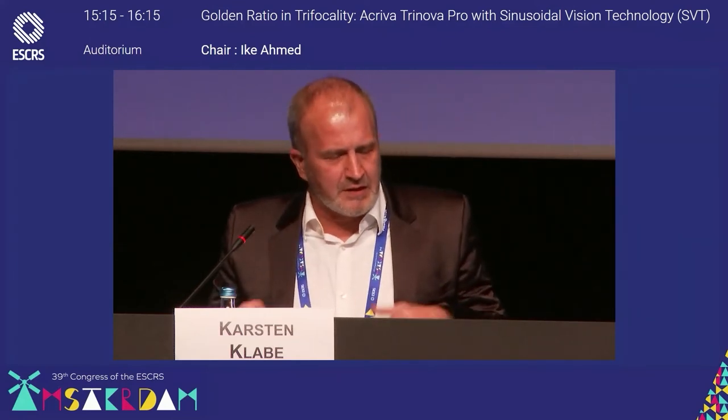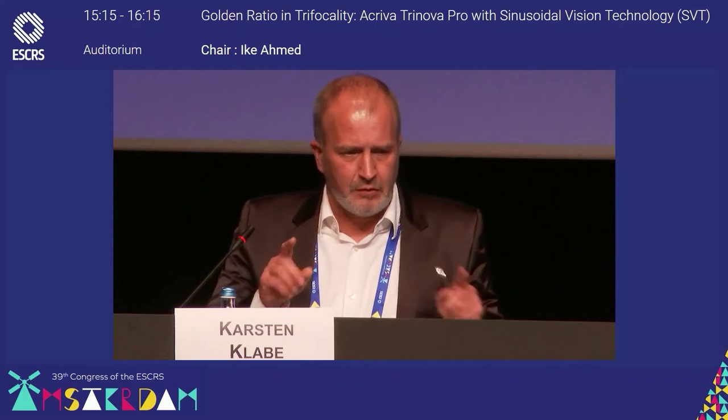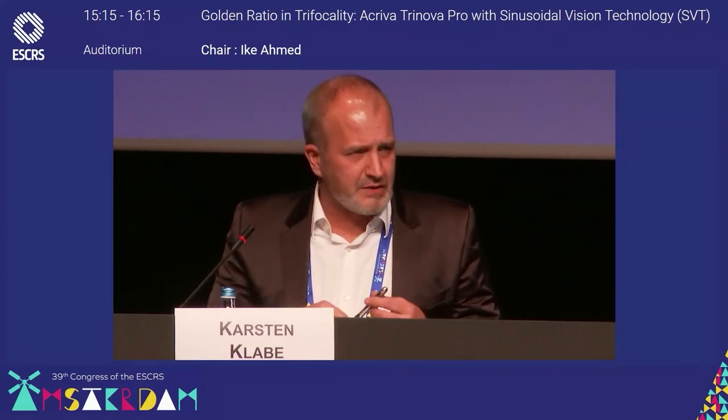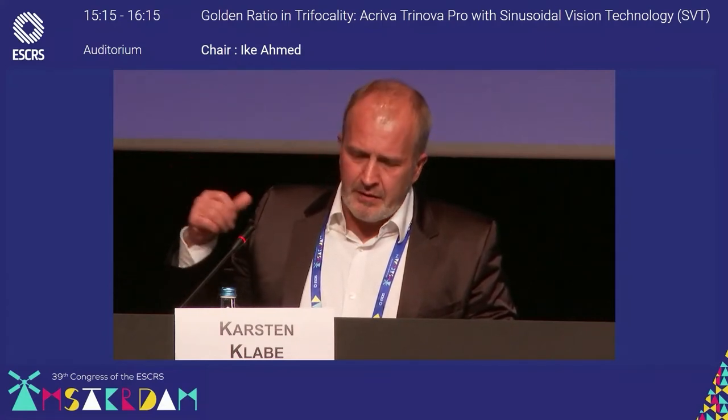If you have a trifocal lens which performs so well, I would always prefer to implant a trifocal. I'm not a great fan of mixing. If we have an equal optic design, probably the EDOF is a diffractive bifocal lens as well, and we can expect the same optical quality, so it could be a solution. But I've often seen in these patients that they have a lack in reading at night. Probably because your EDOF addresses far and intermediate vision, and they have a loss in near vision.